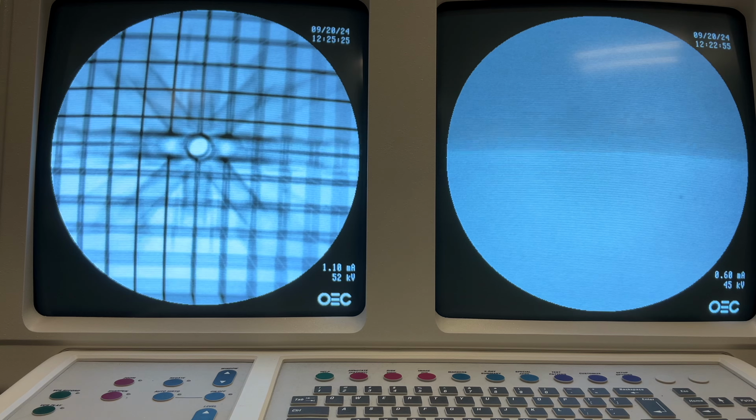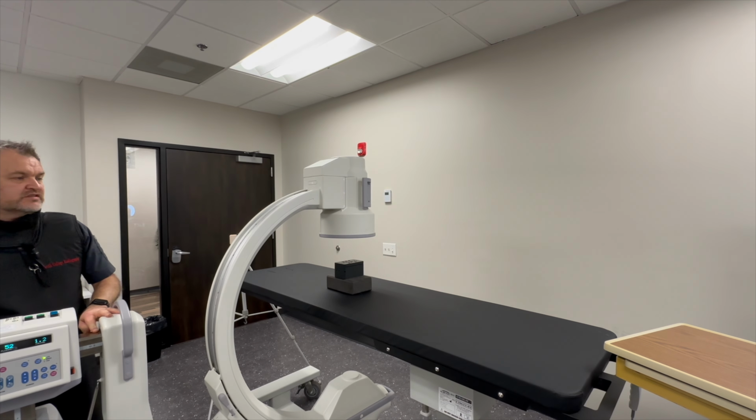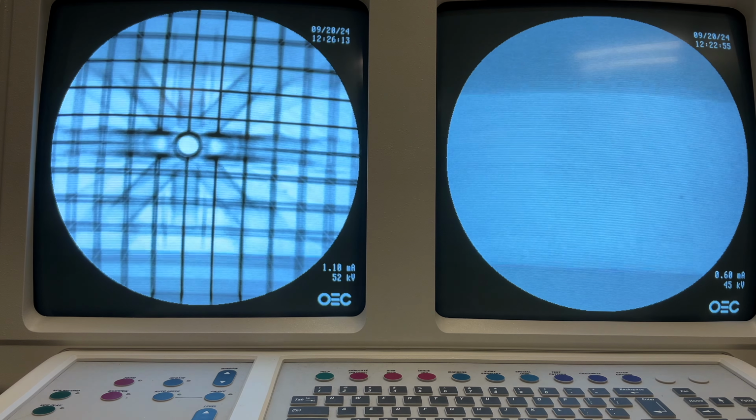Maybe just half a degree. So let's take an image there. That has improved it, but you can see it has moved off center. So I need to keep that in the center because the surgeon is basing their drill path off of that central ray alignment. So my image has to be in the center. Again, it just jumped a little bit. So picture there.